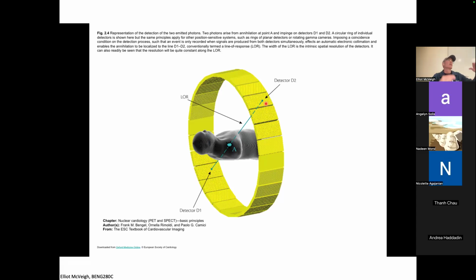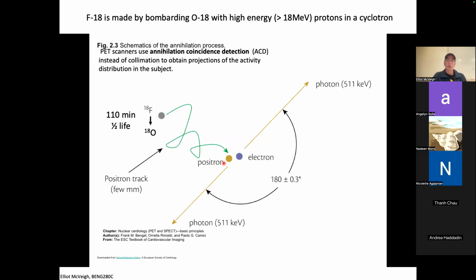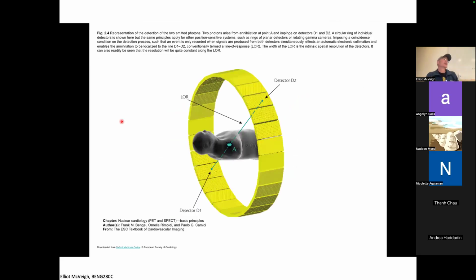The rate at which the list updates is going to decrease over time as the agent decreases its emission over time because it has a half-life. Eventually, it's just going to stop emitting, right? A long time down. So this agent has a long half-life. This fluorine-18 is 110 minutes. So it's like 2 hours. It's still going at half the rate, right? That makes it very convenient to use, obviously. We'll see some agents have half-lives of like 48 seconds or something. So you have to image really quickly, right, to get that done.